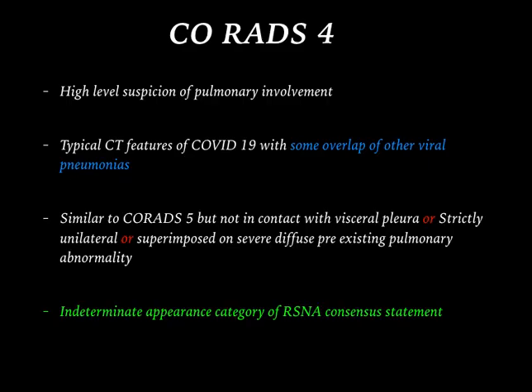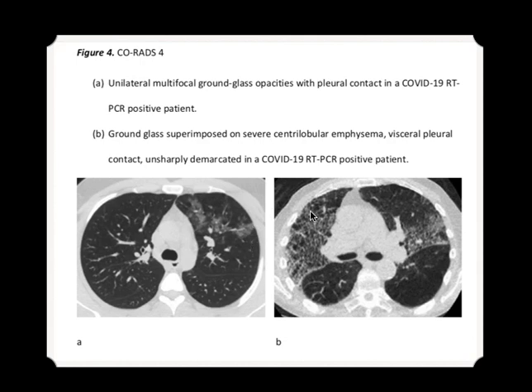CORADS 4 is high level suspicion of pulmonary involvement. It shows typical CT features of COVID-19 with some overlap with other viral pneumonias, similar to CORADS 5 but not in contact with the visceral pleura, or strictly unilateral, or superimposed on severe diffuse pre-existing pulmonary abnormality. CORADS 4 falls under the indeterminate appearance category of the RSNA consensus statement. An example shows a positive patient with ground glass superimposed on severe centrilobular emphysema, with visceral pleural contact present and interlobular septal thickening that is unsharply demarcated.